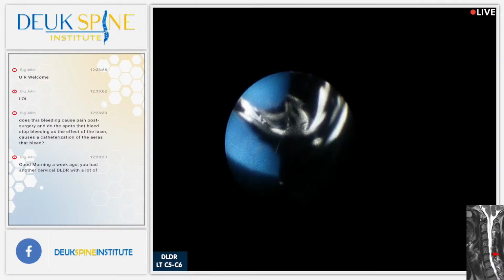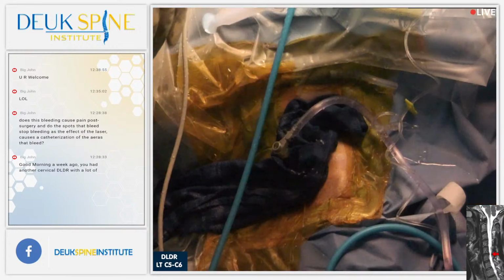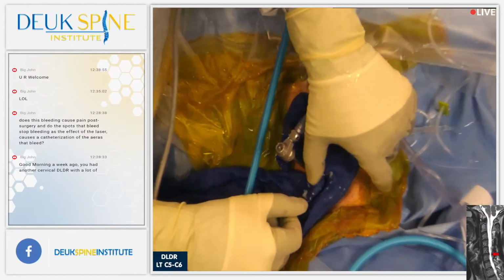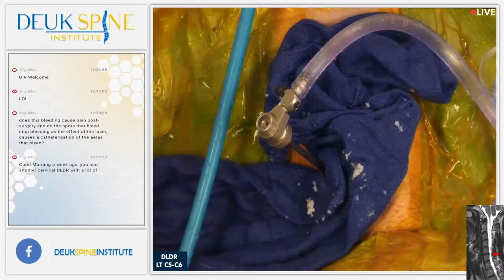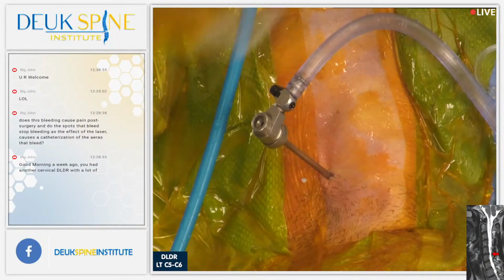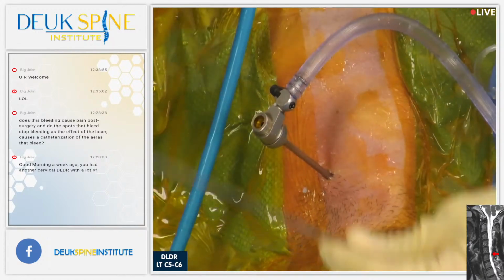Good work, everyone. That was nice and sweet. All right. Henry, turn the light. Check this out, Henry. Look at all that. See this? Yes, we do. Okay, see all these little pieces? These are all pieces of herniation. There's 50 pieces there. Some small, some large. But that's what you're dealing with in a herniation. We're going to irrigate, see if we can get any more out.